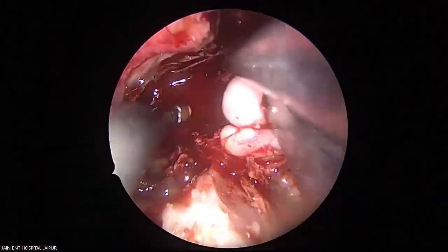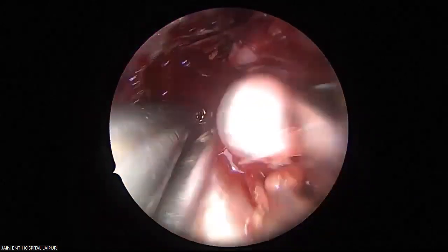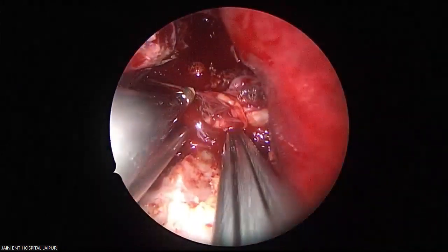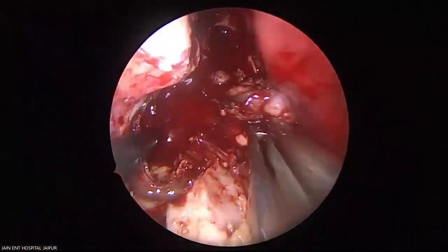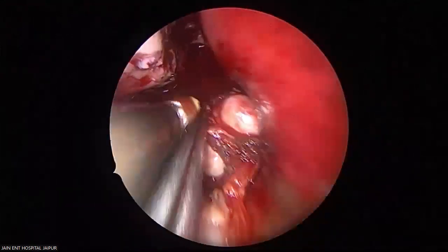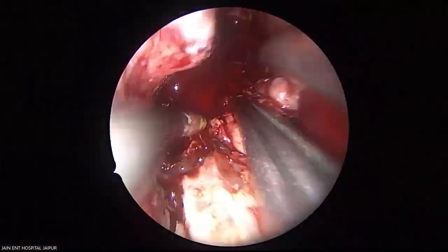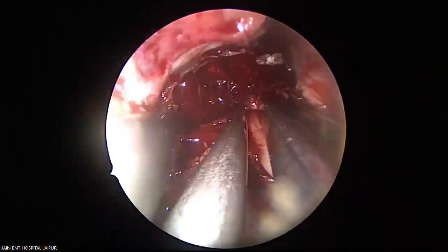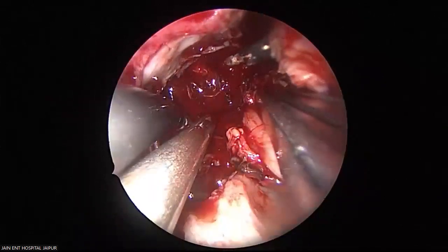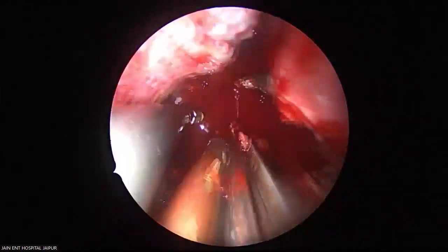Basically, it is coagulation and irrigation that is going to help you. You don't have to put a pack and wait for it to come out. It has to be done under vision. See now, adhesions released and tumor is pushed. Delivered. Under vision, you have to see slowly after releasing adhesion, the tumor has got into the nasal cavity. Can you see? The entire tumor is now in the nasal cavity.